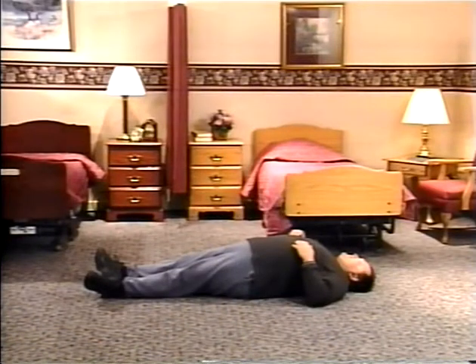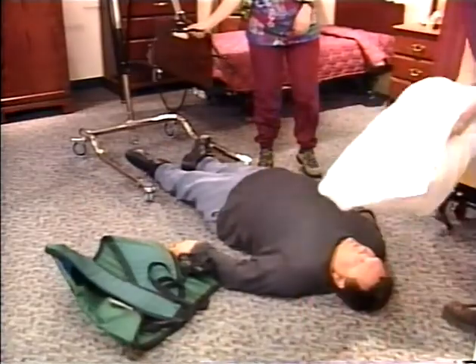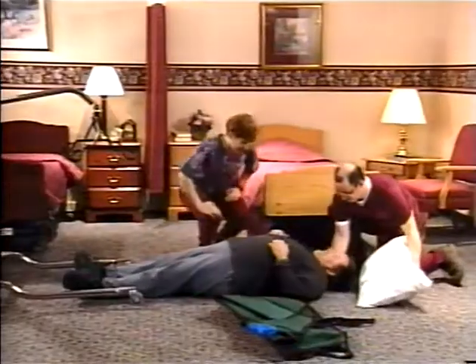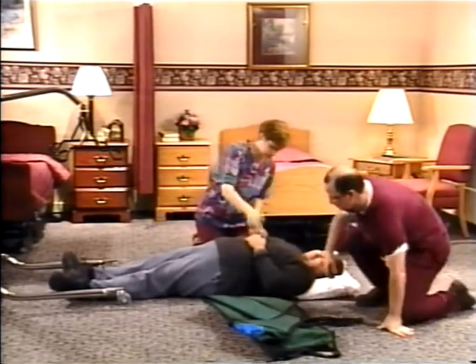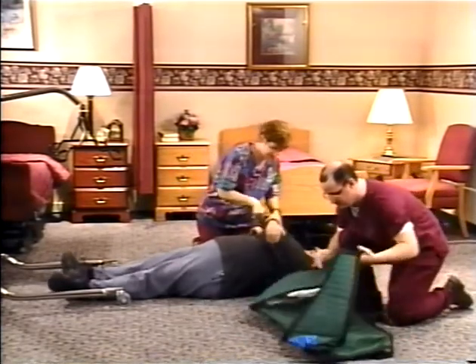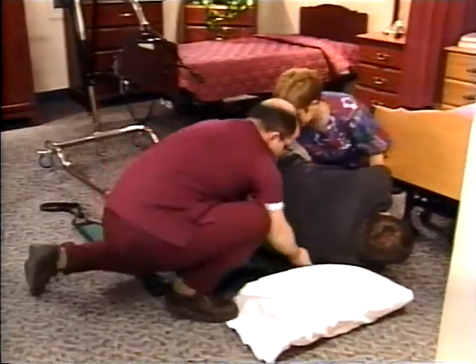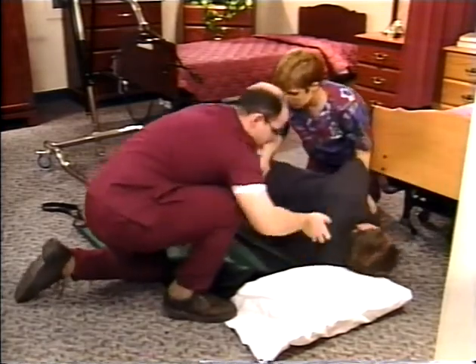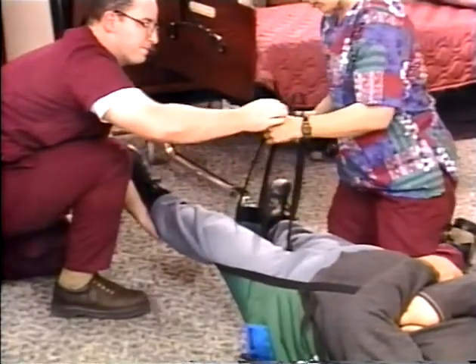A Hoyer lifter may be your best friend when it's necessary to lift a resident from the floor. Here more than ever, take time to review the situation before you begin your lift. Always work as a team, and never attempt to lift someone who has fallen and may be injured unless he's been examined by a medical professional. To lift someone from the floor, install the sling using the log roll method described earlier. Using the steering handles, approach the resident from either the foot or the head, depending on the situation. Place a pillow under him to support his head and neck.